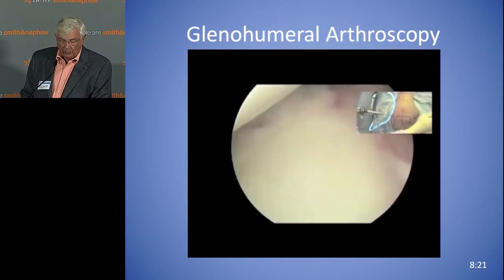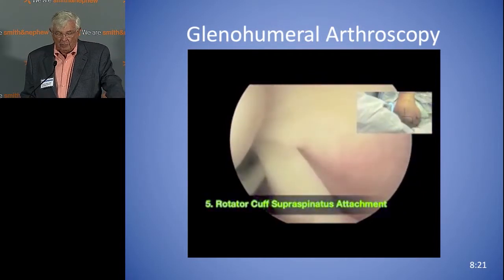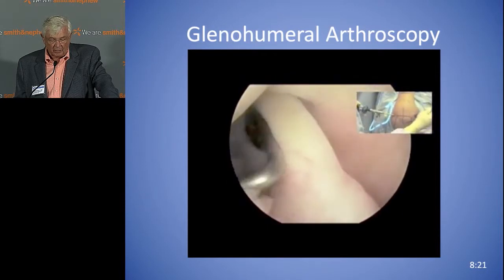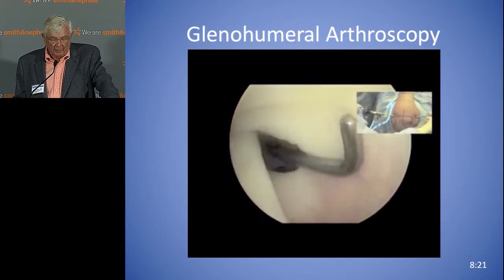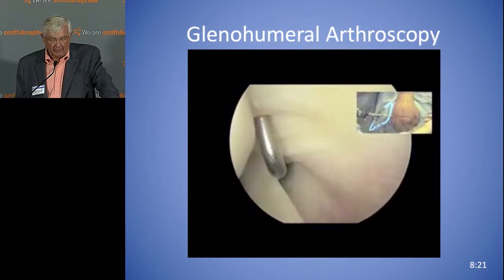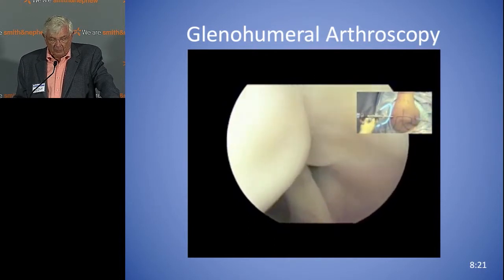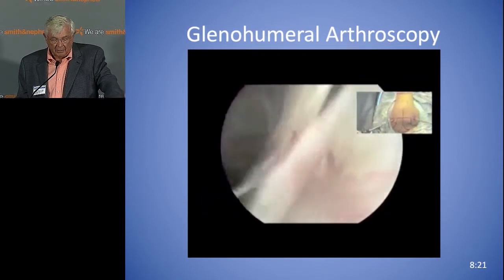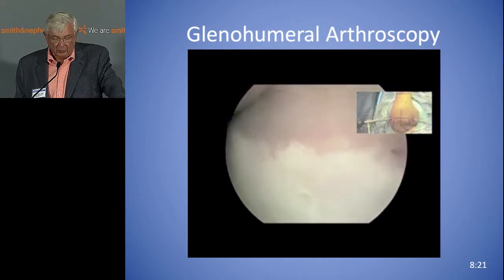You're using a probe, and now we're moving superiorly back to where we started. Now you look up at the rotator cuff — the supraspinatus tendon. This patient doesn't have much of a cable that Dr. Burkhardt talked about way back. You can probe this area; it's a little thinner between the anterior and posterior limb of the cable. Now you rotate the scope looking at the infraspinatus. And then that drops us into the bare spot — so you have to ask, is that a bare spot or is that a Hill-Sachs lesion? The bare spot is right up there adjacent to the rotator cuff tendon.